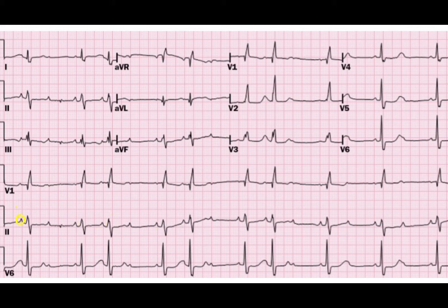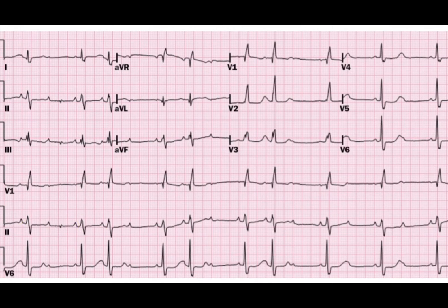Since the P-to-P interval is constant here — as you can see: 300, 150, 100, then again 300, 150, 100, and again 300, 150, 100 — the P waves are marching at a regular interval, meaning they are coming from the same focus.